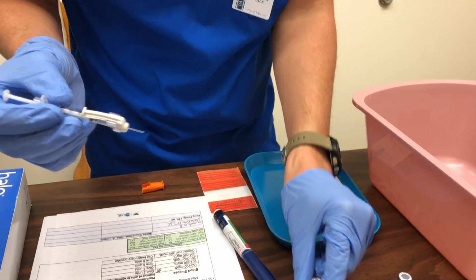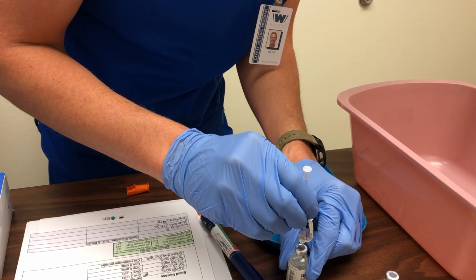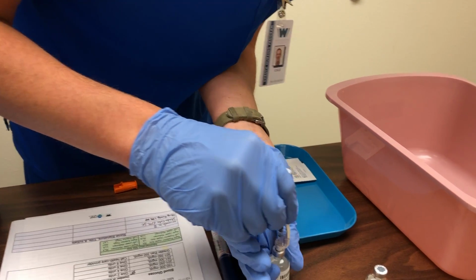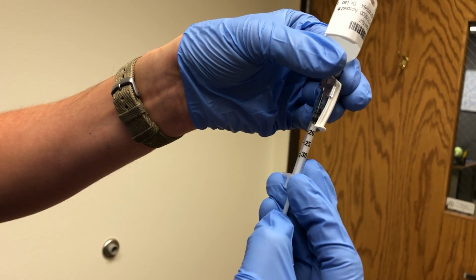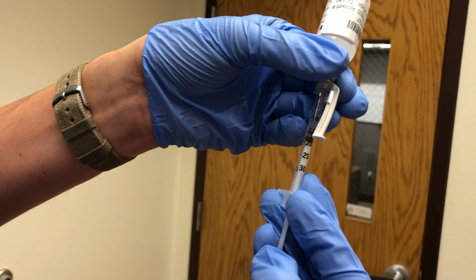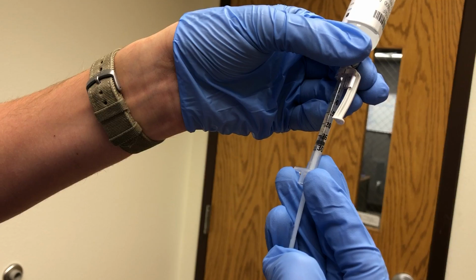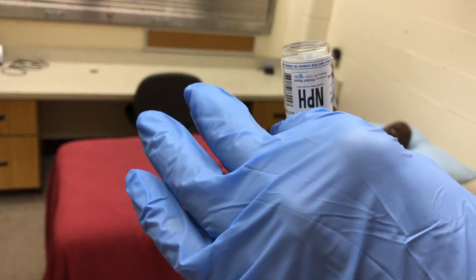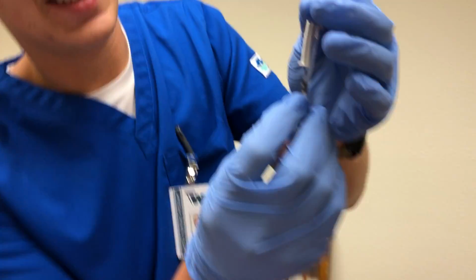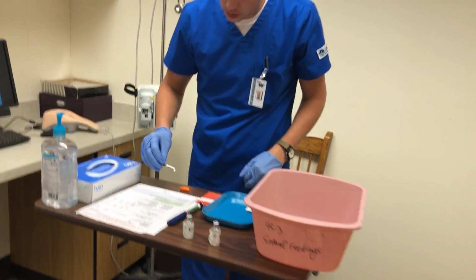And then we can go in and grab the last 15 units of the NPH. And so then that'll bring us all the way to 25 with that 15. So there's an even 25. Okay. And then I'll do the scoop technique.